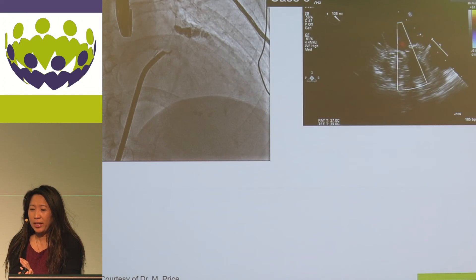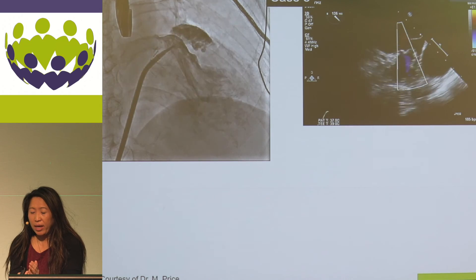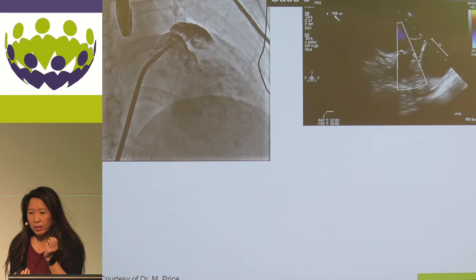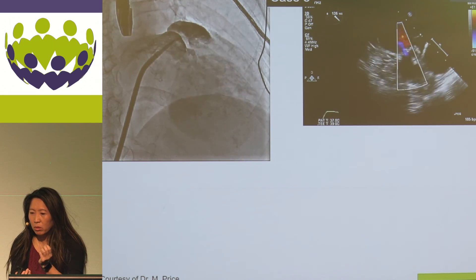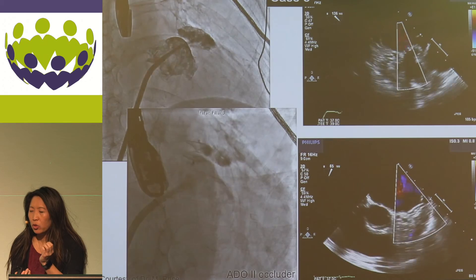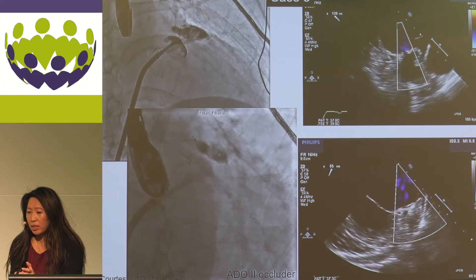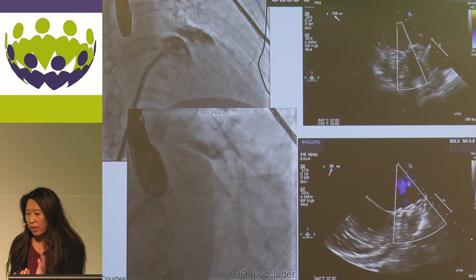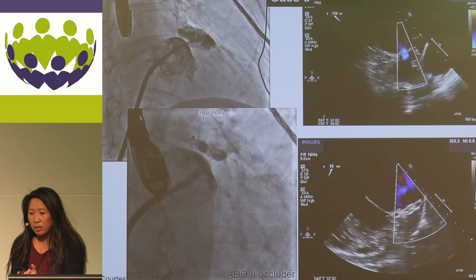Another example is courtesy of Dr. Price, following a Lariat implant. Not infrequently, as shown earlier, 15 to 20% would have these central gunny sack leaks following a Lariat procedure. These small holes are quite amenable to placing ductal occluders or AVP4. Utilizing a 5 French guide catheter to place the ductal occluder completely sealed the device.